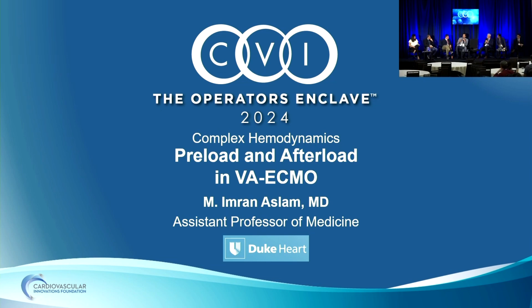I think this case illustrates how, in the first talk, we heard about how underutilized PAC is, but we don't talk about how underutilized the information we get from the PAC is, how little we understand the hemodynamics in a lot of the cases. Here we talk about not very high filling pressures, but the patient's completely vasoplegic, post-cardiac arrest. That plays a big role in the filling pressures, and it plays a big role in the interaction between LV and RV. For a patient who was living at home, had a LAD infarct, a wedge pressure of 20 is probably very high in this circumstance of vasoplegia.